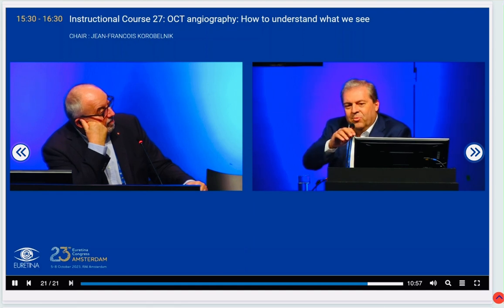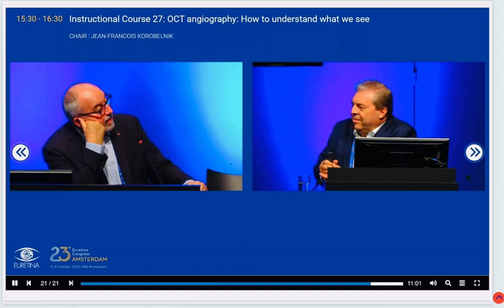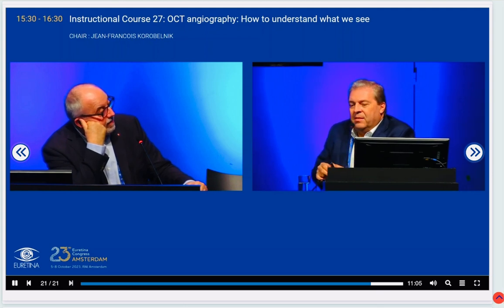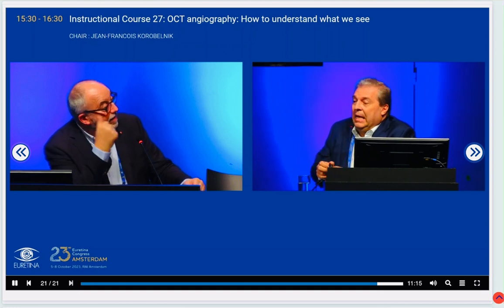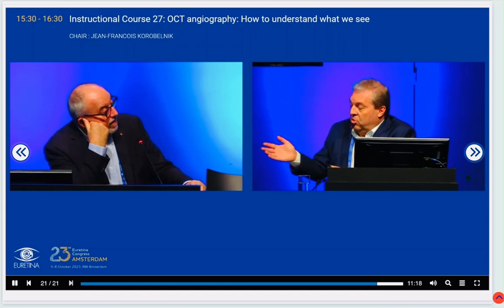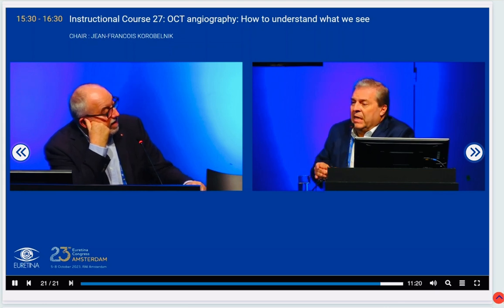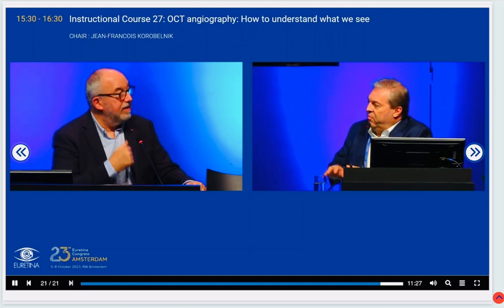This is a very good question. The first limitation is the cost of the equipment. This is a very different equipment, swept source. I use the Plex Elite, which doesn't give you metrics, but gives you the wide field that's important. And the Canon is even wider. Yes, it's true, I don't have experience with Canon. With the Zeiss machine, you must have the montage of pictures.